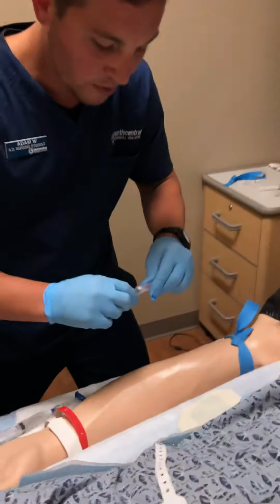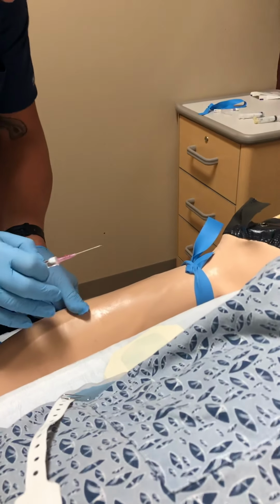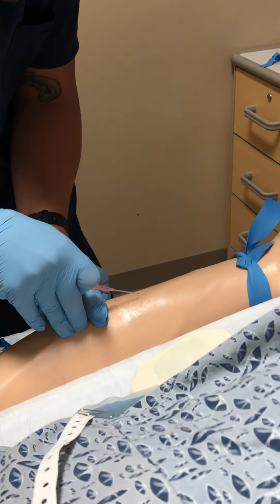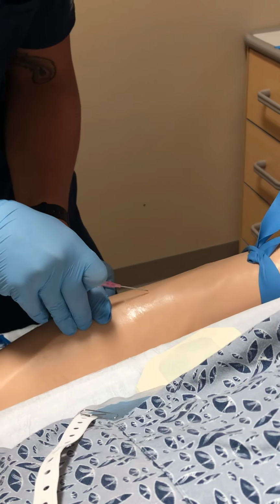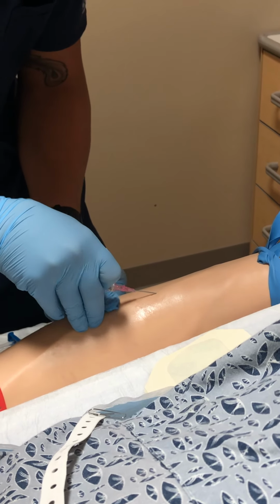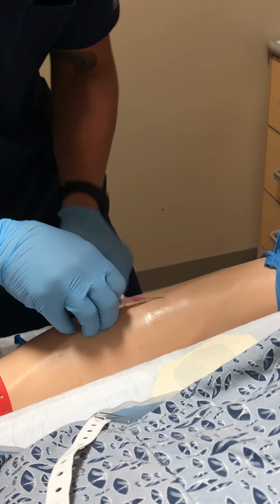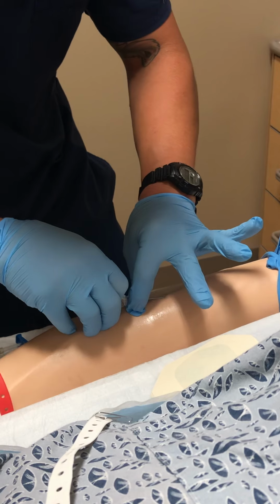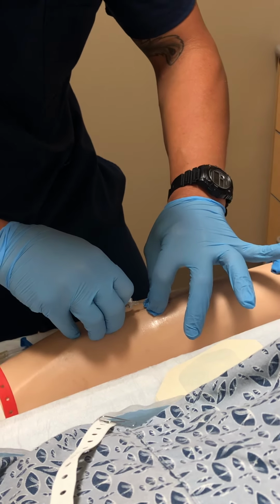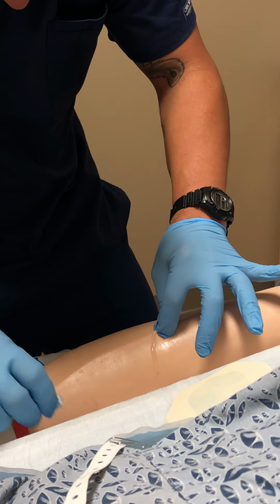So what we do: caps off, bevel up, taut with your thumb, okay? So you're gonna go to about 15 to 20 degrees here. And when we get a flash, then you level, go down, insert another half centimeter. You're gonna progress your catheter. Okay, you're gonna pull out, lock your needle.